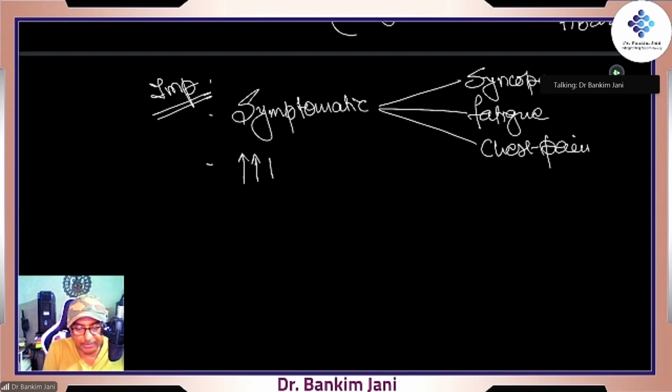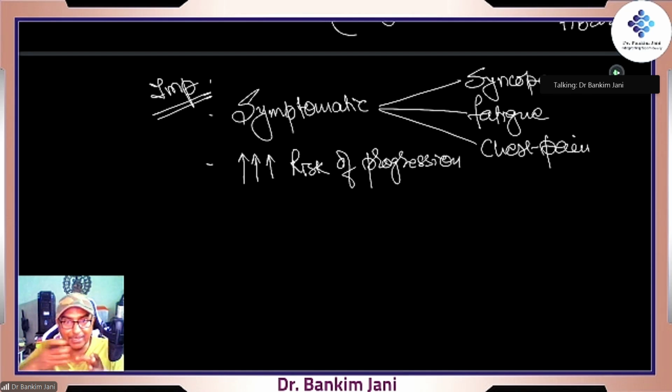This is very high, right? I'm writing it like this. Extremely high risk of progression. It can worsen. Now see, when it was gradually increasing and a beat was missing, we were not this much alarmed, right? But when this is happening, this is more. Solution?